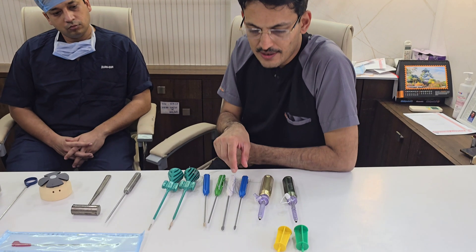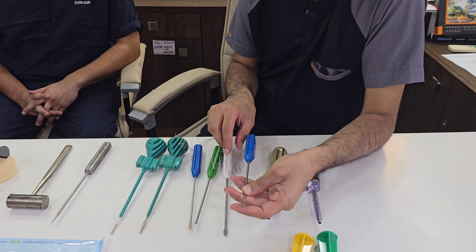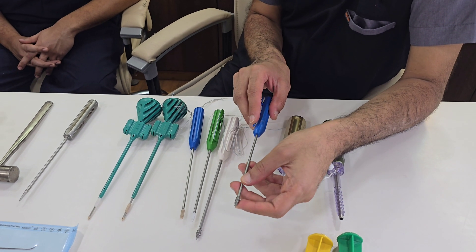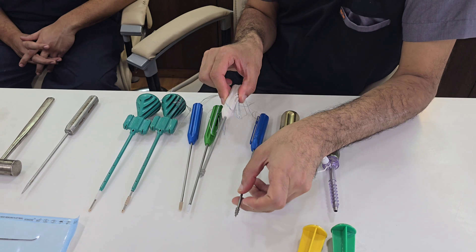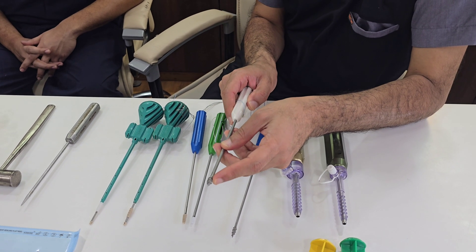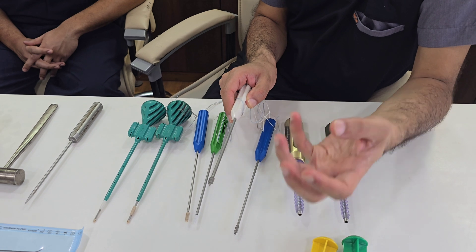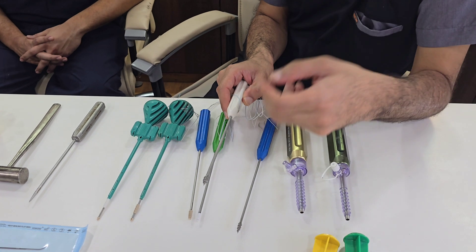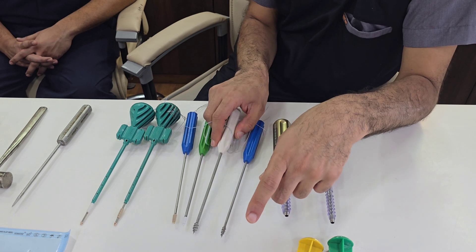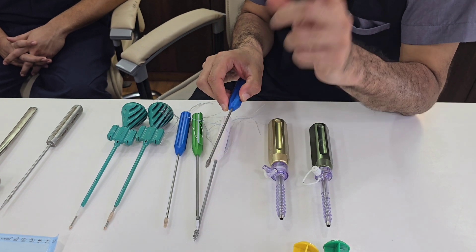This anchor is called the corkscrew and is available in multiple sizes. This is a 5.5mm option, and if the patient is osteoporotic, you have a 6.5mm option as well. If the patient is osteoporotic and the smaller anchor pulls out, you have the option of placing a bigger anchor. So this is the 6.5mm anchor and this is the 5.5mm anchor.